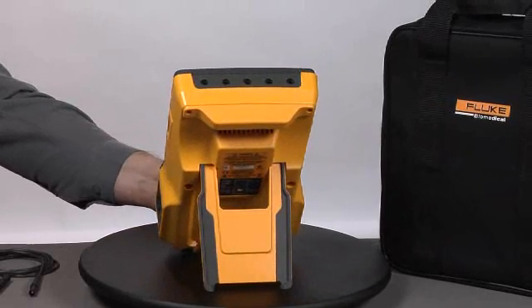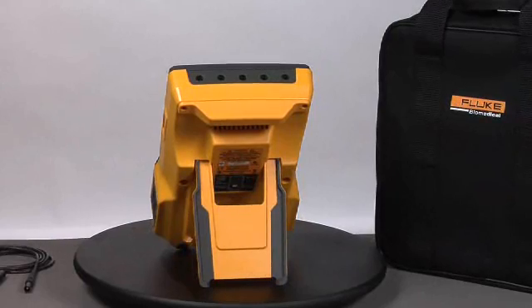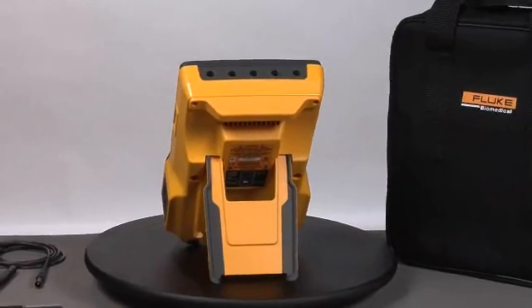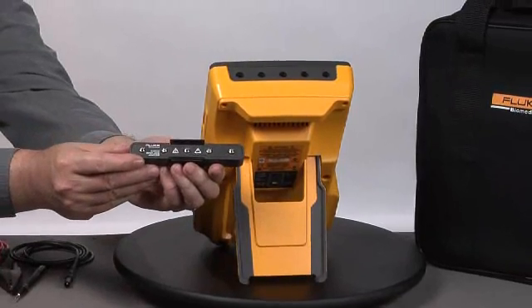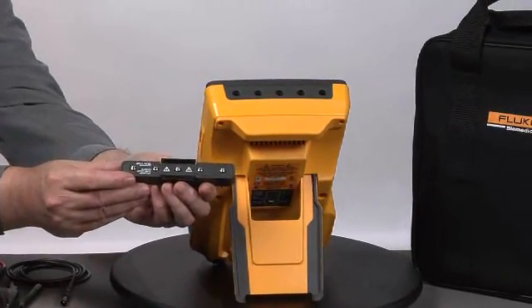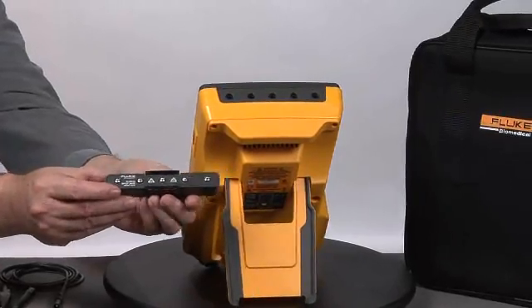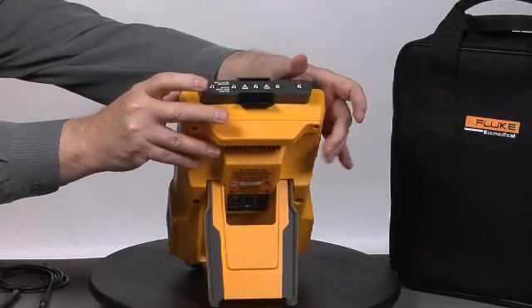Across the top, we see the applied part posts for connecting things like ECG leads and other applied parts that connect to the patient. To make it easy to connect ECG lead wires for pinch or snap leads, we have the banana-to-ECG snap connection, which plugs directly into the top of the device very easily.